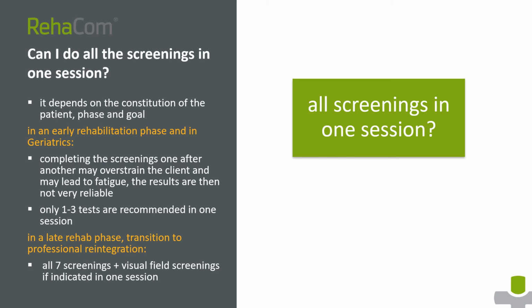Only 1 to 3 tests are appropriate in one session in this phase. In a late rehab phase and/or when planning the transition to professional reintegration, all screenings may be indicated to perform in one session.